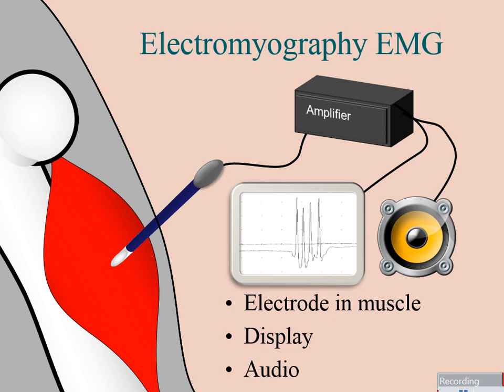So your ear is much better at picking up these kind of things than your eye is. And so that's why we always listen to the electrodiagnostic recordings, and you're going to hear some of them here. And they talk a lot about what they sound like.